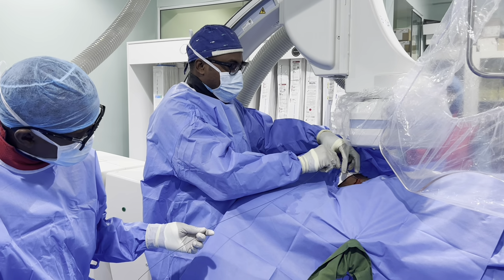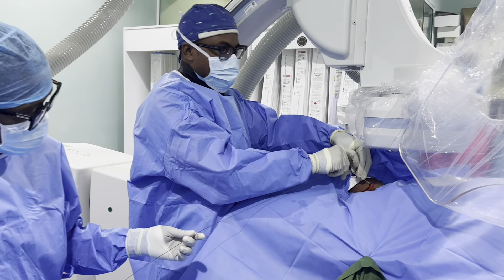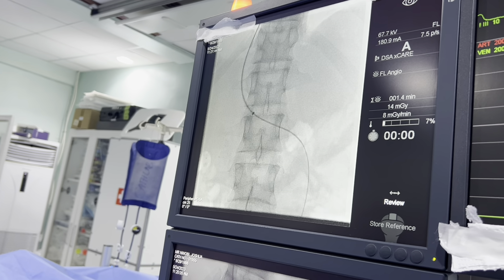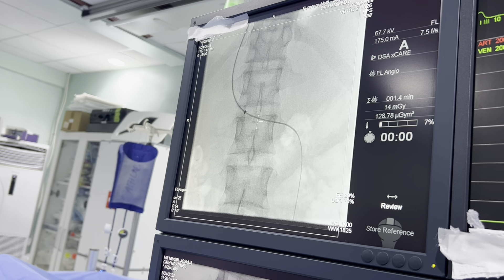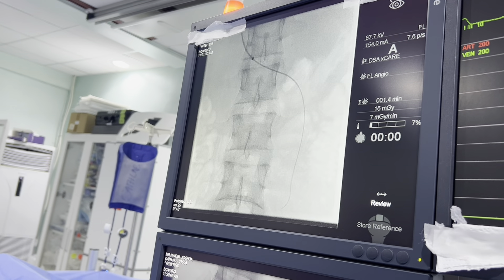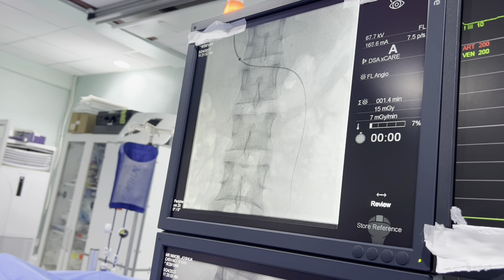You're going to see that wire go down into the heart. Now we're going down the gonadal vein on the left side. You can see the wire has come down already, so we're going to try to get further down that vein and then the catheter is going to be pushed.